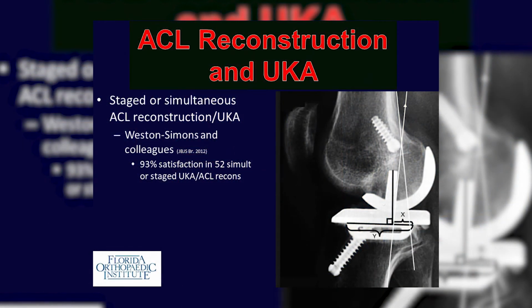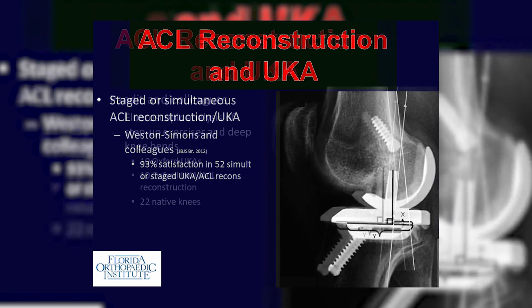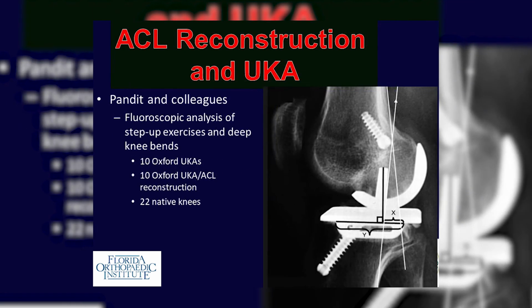There is substantial evidence supporting this concept of partial knee arthroplasty and concomitant ACL reconstruction. This is Weston and Simons, who published excellent satisfaction and survivorship in 52 simultaneous ACL and UKA reconstructions. This is definitely an option.